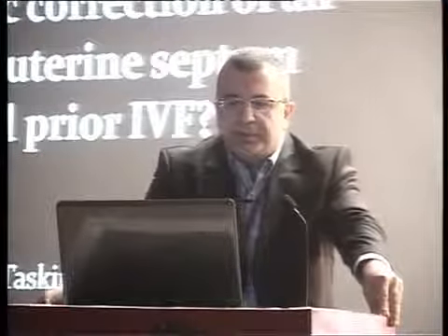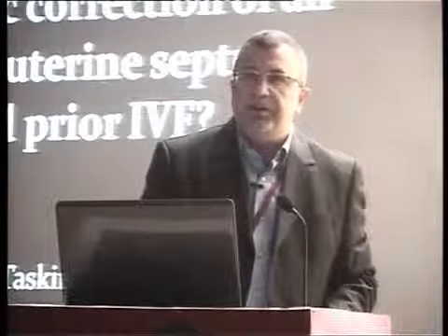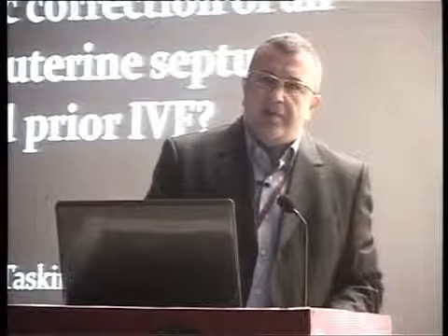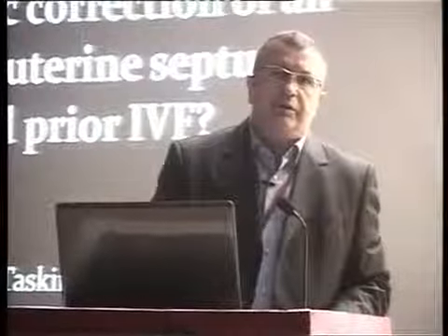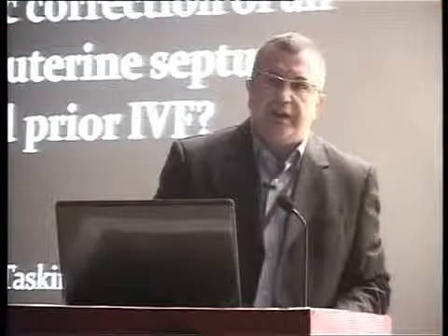My topic is hysteroscopic correction of an incomplete uterine septum justified prior to IVF. As we published in 1995 from Baylor College of Medicine, we have been using office hysteroscopy since then, and we have published that screening office hysteroscopy should be done prior to each IVF cycle to rule out any uterine anomaly.